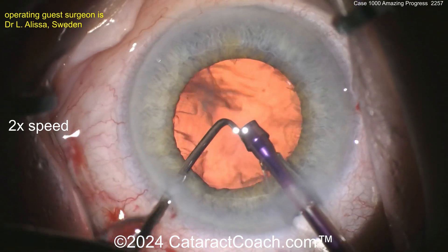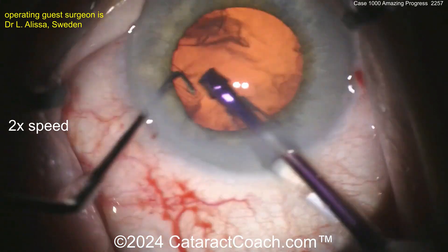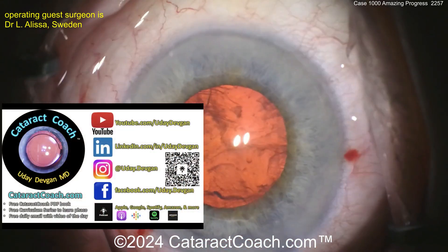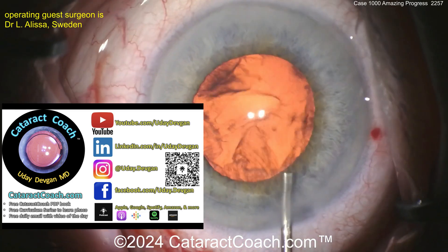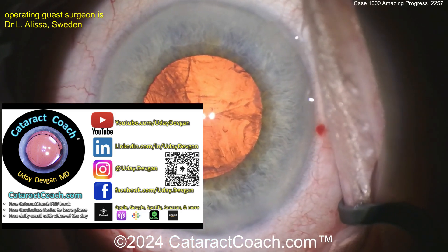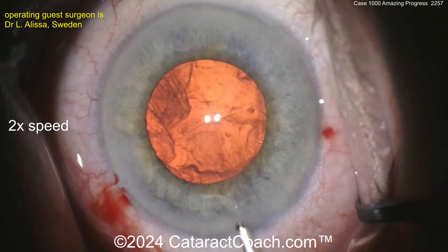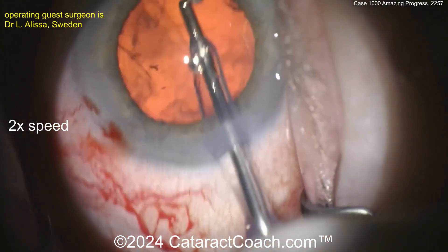Cleaned up real nicely — get all those little fragments out. As we switch over to the IA probe, let me tell you about cataractcoach.com, our teaching website. You want to be a better surgeon? There are so many great resources: a free PDF book, a curriculum series, a link to the podcast, and an incredible search engine. You can search beginning cases, capsular rupture cases, anterior vitrectomy cases, post-sharonal cases — all categorized. Over 2,200 videos all there.